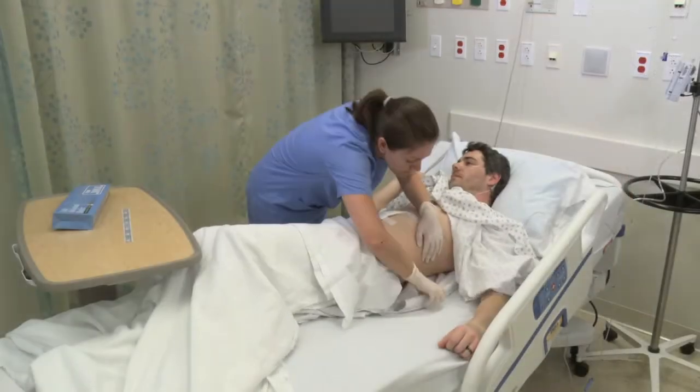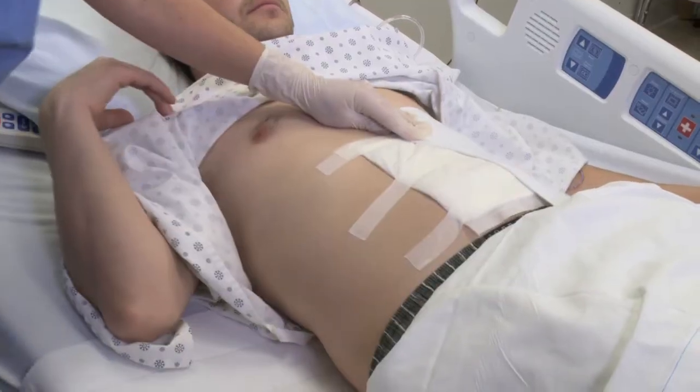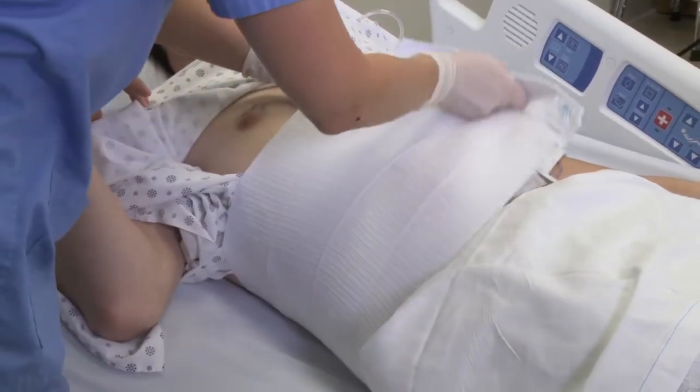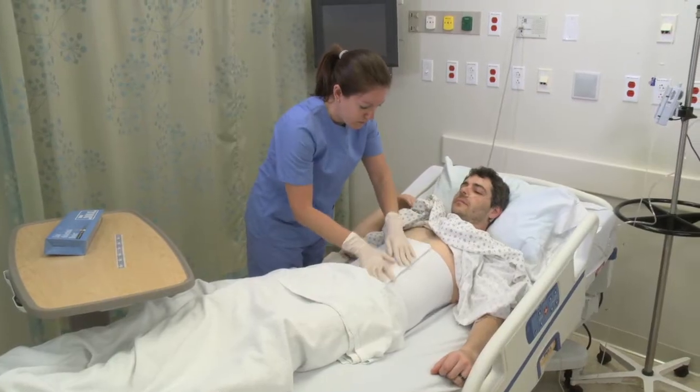It's important to correctly and adequately stretch the binder. Remember, it won't restrict breathing. To the contrary, it's the stretching and compression which facilitates deep breathing.